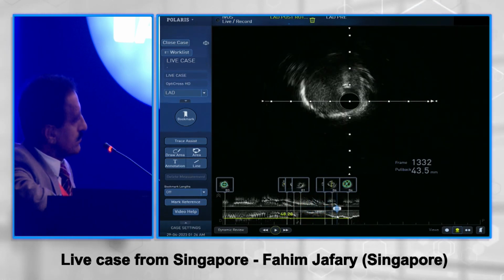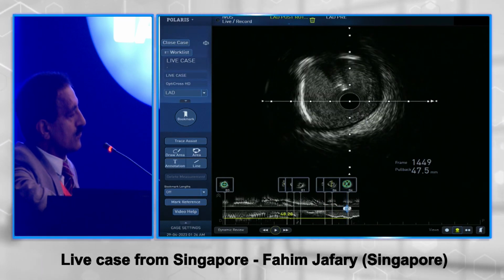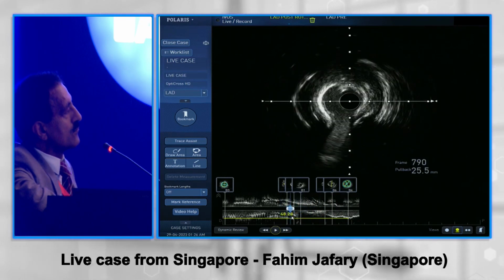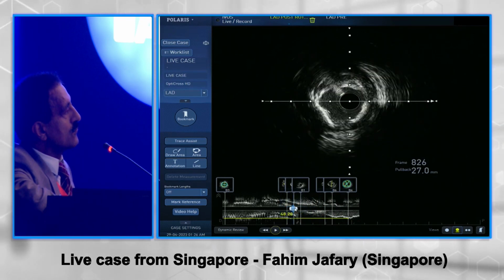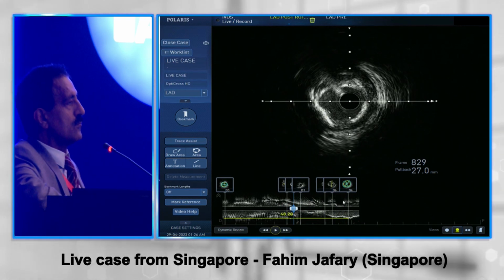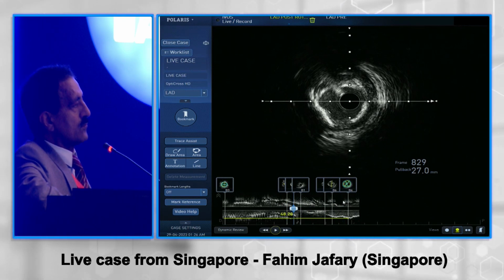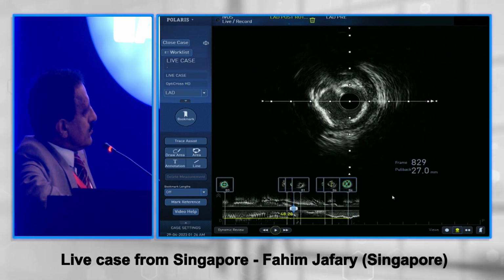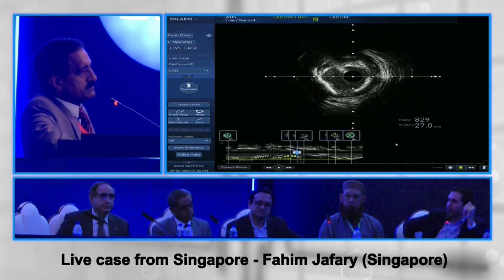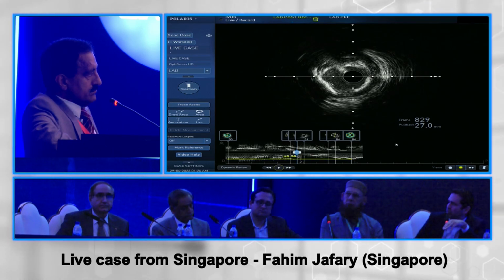So I had 2 questions. First, whether to choose IVL versus rota over here. Why did they decide to go with rota instead of IVL? And the other is, in terms of plaque modification versus debulking, I mean, Asad felt he wanted to do more, but if you had gotten 2 cracks in that arc, at the 11 o'clock, 12 o'clock position, in 2 different spots, and angiographically it looks much better, you're hoping you'll get adequate stent expansion. I guess you wanted to do more over there.